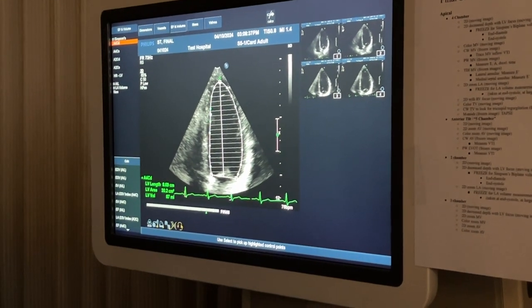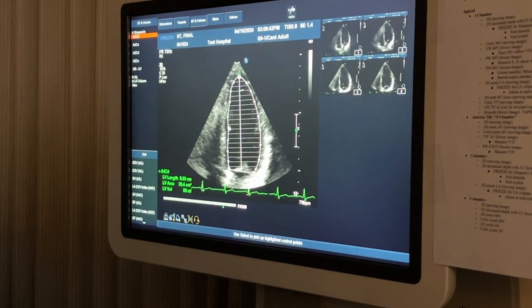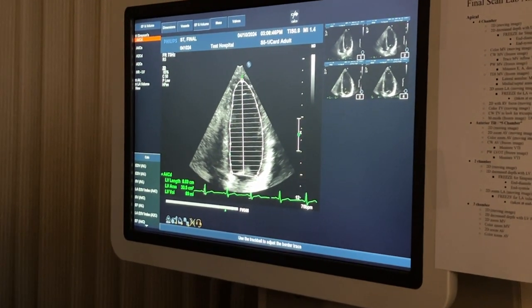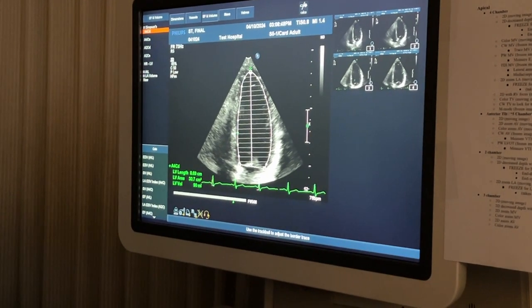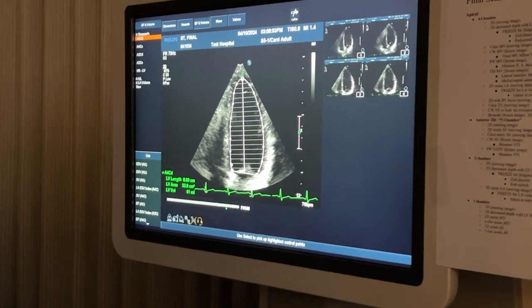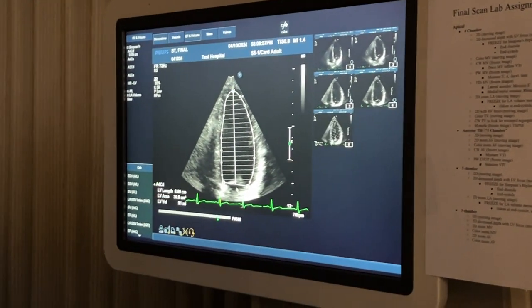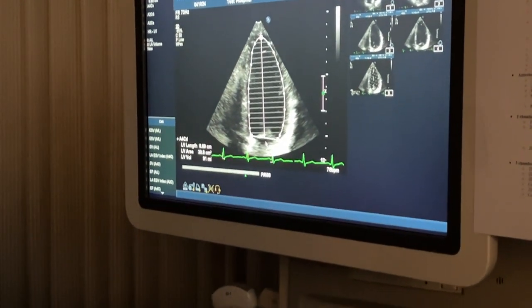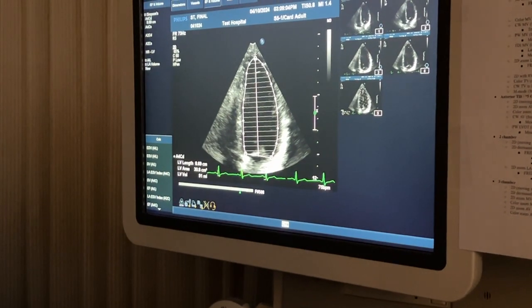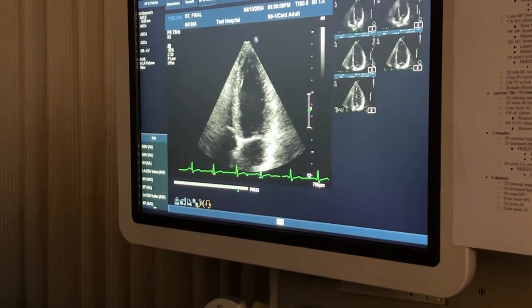Again, this is kind of an ambiguous measurement, so if you guys don't get it exactly, that's okay. We're still working on knowing where the endocardial border is. I'm being really picky with it. Okay, I like this. I'm gonna take a picture of it, but a frozen picture since it's frozen. Print. And then I'm going to get my pointer out of the way, because right now if I scroll my trackball, it's just my pointer.